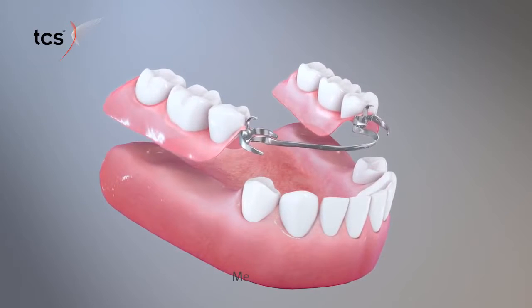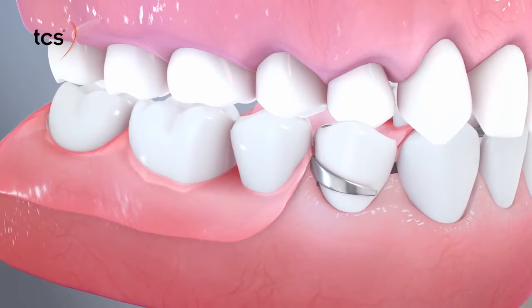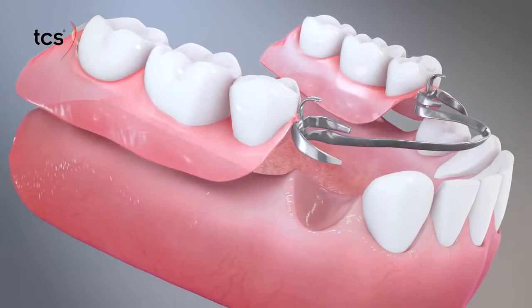Most removable partials use metal clasps for retention. As natural changes occur in the mouth, the rigidity may cause it to rock slightly under mastication, damaging the enamel of the supporting tooth and even loosening it, which may require extraction.